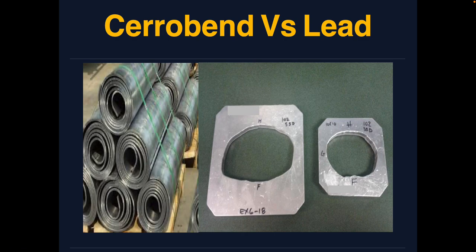The last part of the lecture I wanted to talk about, I think there are a lot of things we need to discuss, but I think it's too much now. The one I would like to talk about is the protection used for the normal tissue. How much thickness of lead is needed to protect your normal tissue? So for example, I'm using a 16 MeV beam, and I want to protect the normal tissue to the maximum.